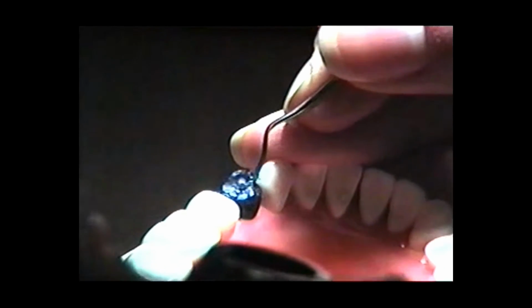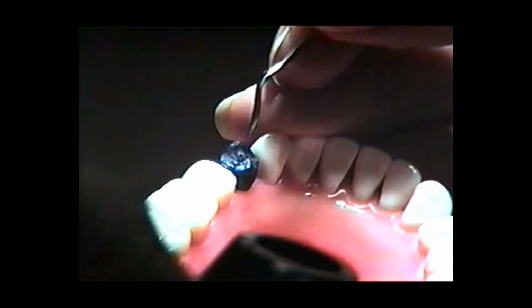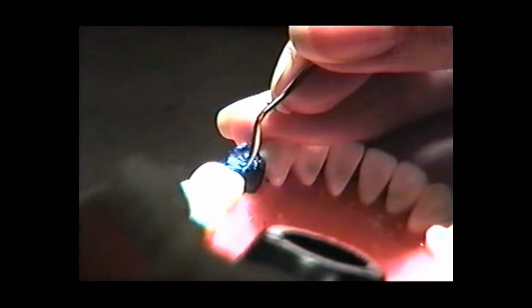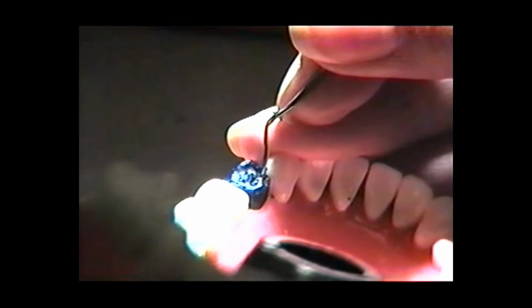So the mesial fossa is pretty prominent on this tooth. I'm going to dig away a little of the wax there. I'm going to look at how this distal comes down. And then the central groove.